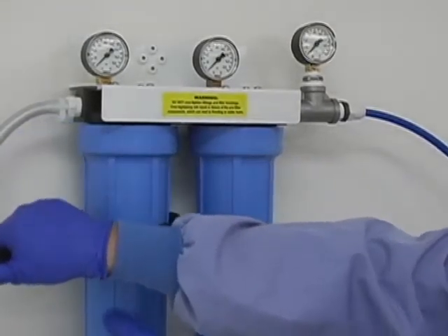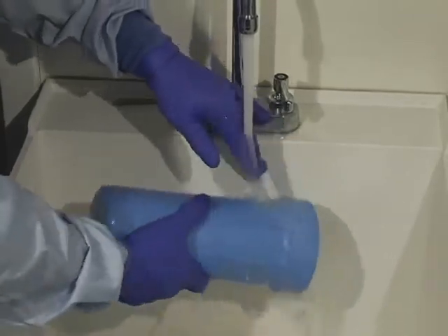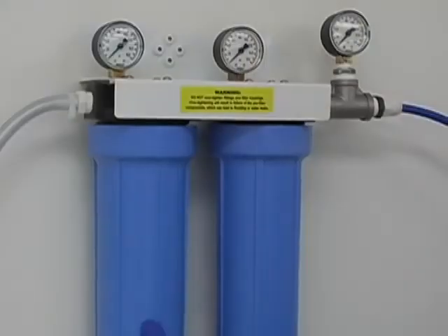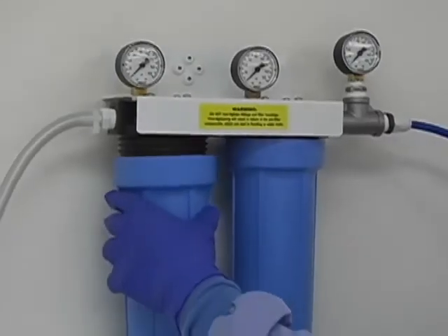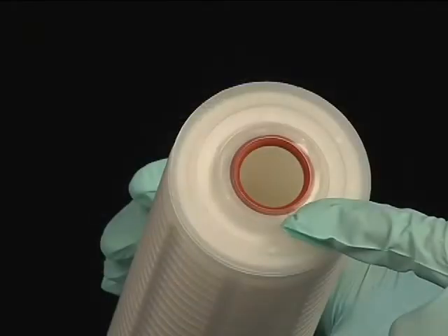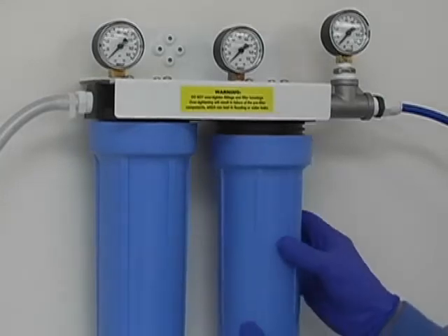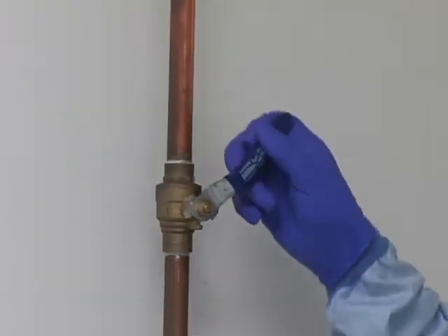The gauges should read 0 PSI. Place a container under the appropriate filter to catch excess water. Slowly loosen the filter housing with a filter wrench. Remove the filter, discard it, and any water in the housing. The two housings can be cleaned by washing and brushing with neutral pH low-foaming medical grade detergent, rinsed, then dried with a lint-free cloth. Replace with a new filter of the correct size. The first filter incoming water encounters is the 1 micron filter — place a new filter directly into the housing. The second filter is the 0.45 micron water filter; the rubber O-ring should be up and attached to the underside of the filter assembly. Before reattaching the housing, ensure the O-ring is in place and lubricant is on the O-ring and housing threads. Reattach the housing and hand-tighten — do not over-tighten. Turn on the water supply and check for leaks.